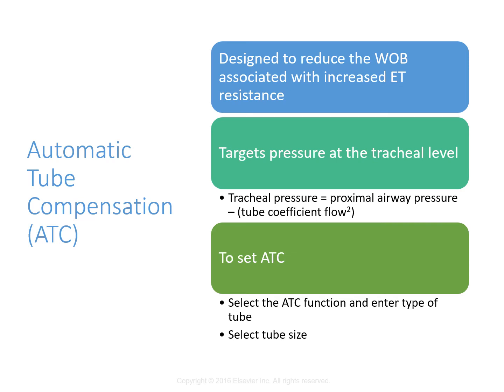So that fixed level of pressure can be too little support if you have a really high or fast inspiratory flow rate, or it could be too much and feel like a garden hose is pouring down your tube, right? So that flow rate could be too much or too little. It could be excessive, too much tidal volume, too much flow rate, and be very uncomfortable for the patient. And that's a big thing to be concerned about, right? Especially if we're using lower sedation levels.